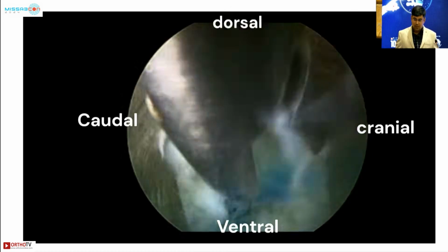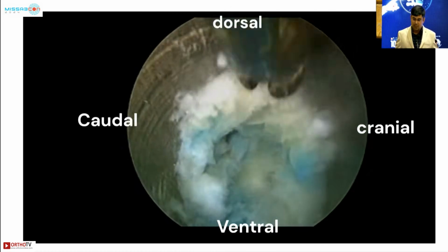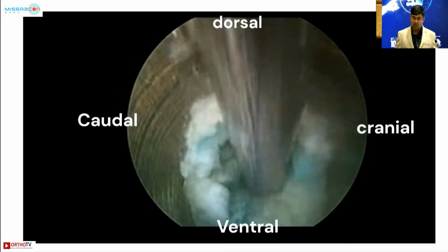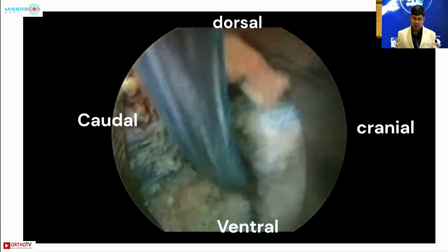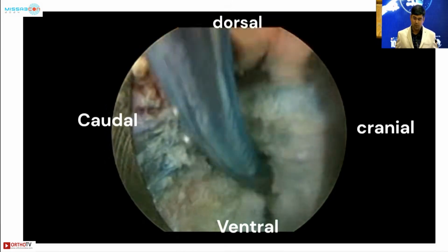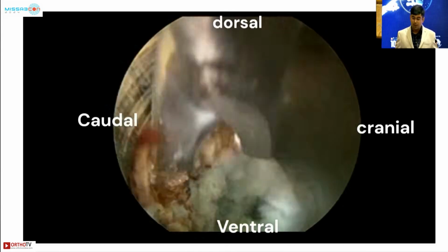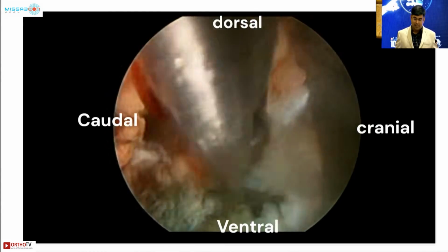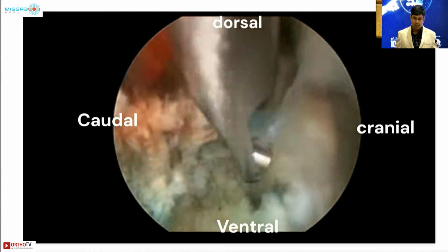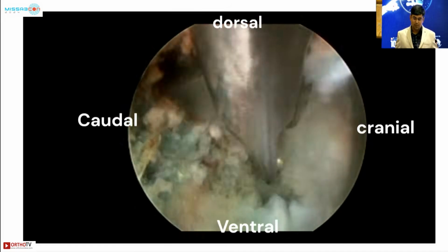So, initial removal of the loose fragments, subannular decompression, and I thought if I gradually come out, I'll be able to have a half in, half out view. Then I can cut the annulus and have the nice view of the decompressed lateral recess and can see the traversing nerve root. But to my surprise, I was not able to do so.